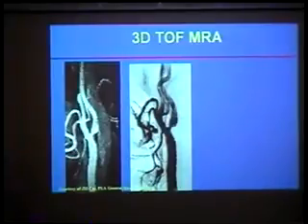There have basically been established procedures that each time you see a stenosis, like I showed here, in this case a carotid artery, this image is actually an MR image. This one is a digital subtraction angiography showing pretty much the same location. You can get a fairly good sense of where the stenosis is. And then the current clinical practice is, whenever you see stenosis like this, if the stenosis is over a certain level, then you operate on those patients.